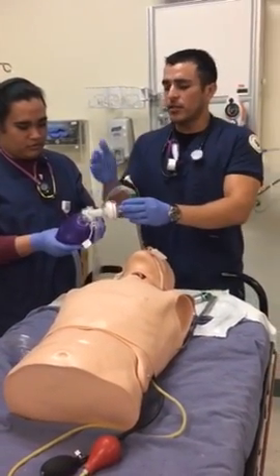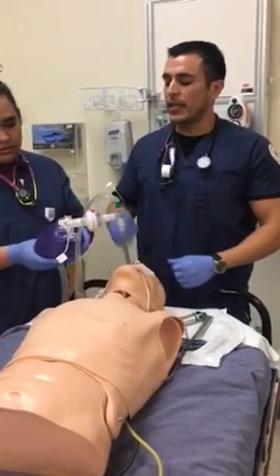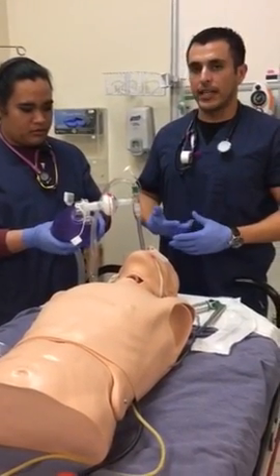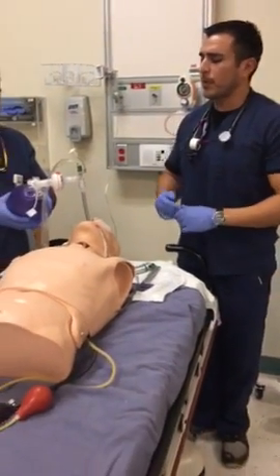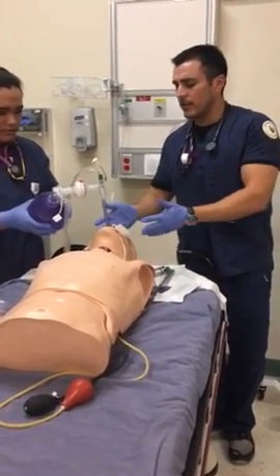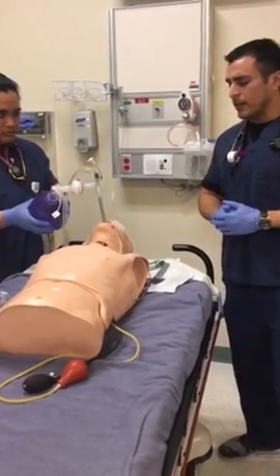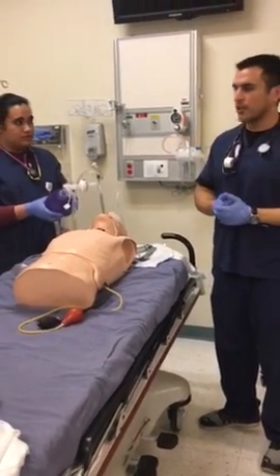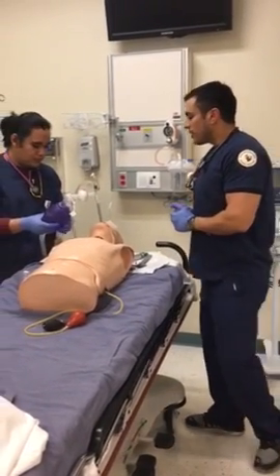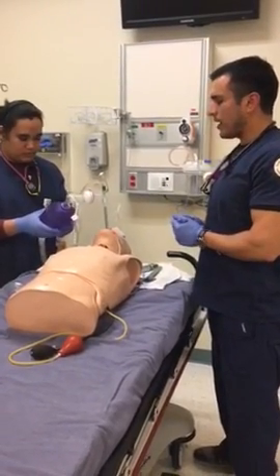We have the suction inserted, we have the humidity inserted. Again, if it wasn't an HME, we could be using something like a heated wire circuit, and that would pretty much be that. After that's done and the patient is on the vent, we could order a chest x-ray to confirm tube placement. Again, we would want to make sure that it's 2 to 3 centimeters away from the carina.